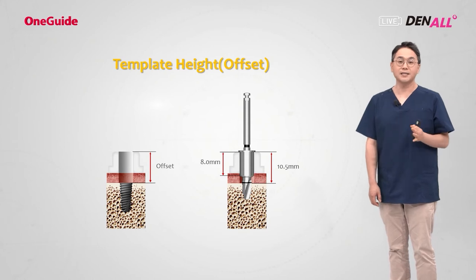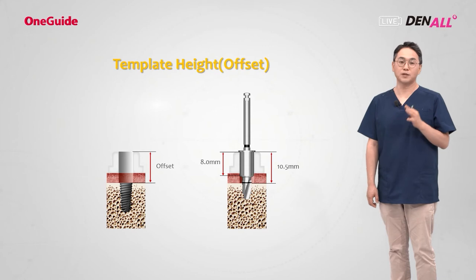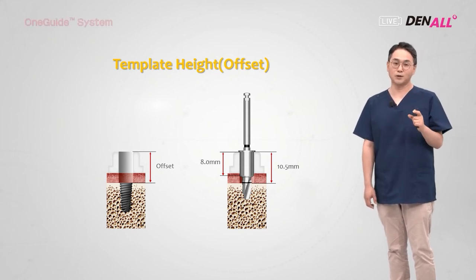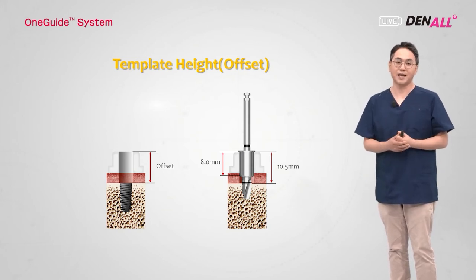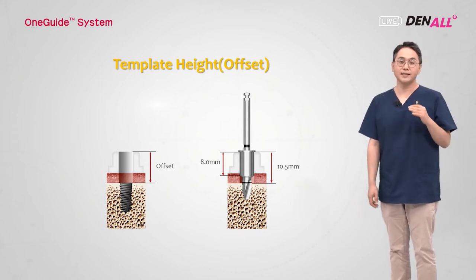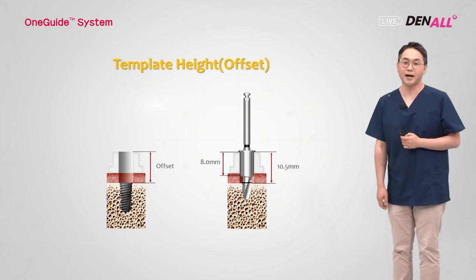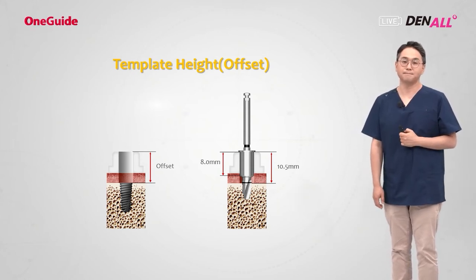It varies depending on the system. To use OSTEM's OneGuide, you need to understand the offset of the system and use the dedicated kit to drill and place an implant through the offset. Thus, the dedicated OneGuide kit is necessary. In other words, offset is from the top of the implant to the top of the guide hole that is to be made. OneGuide employs a single offset of 10.5 millimeters.